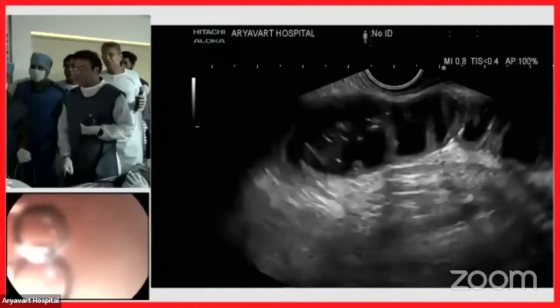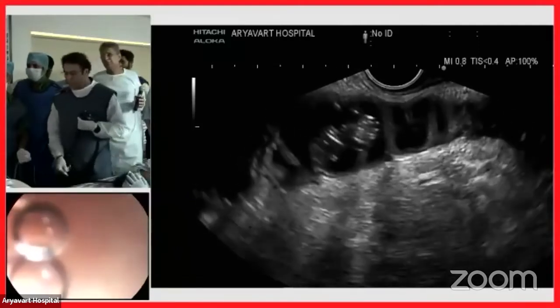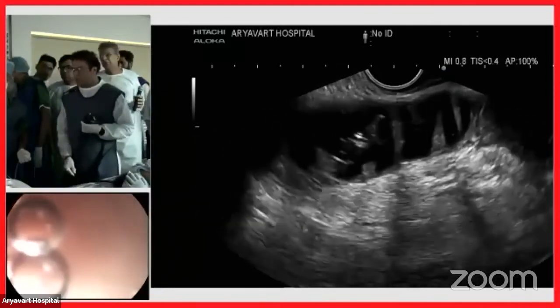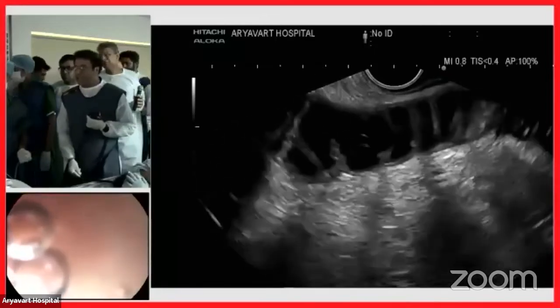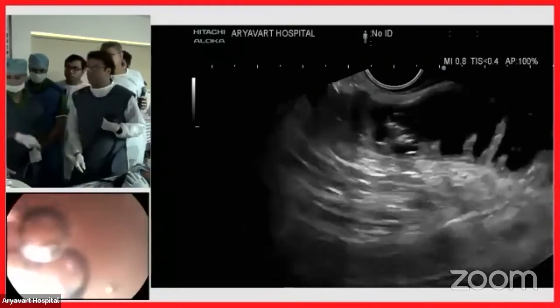So we are pretty certain that this should be a small bowel loop and not a transverse colon or a colonic loop. So here, one thing is important, that you want a distance of at least 4 centimeters for the cautery enhanced stent to enter into. So that segment should be available before you think of puncturing. So Sony, just freeze this and can we just measure the size?